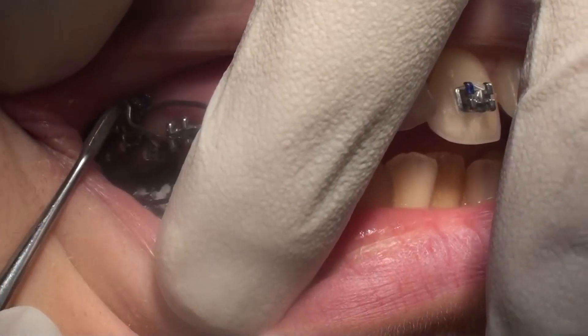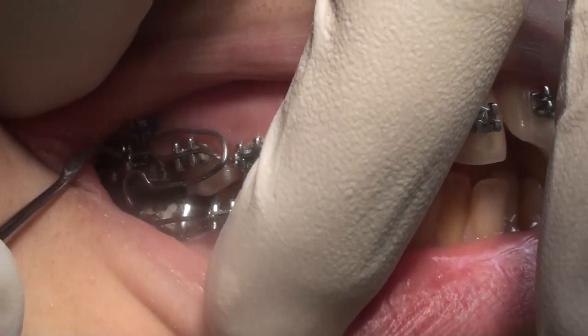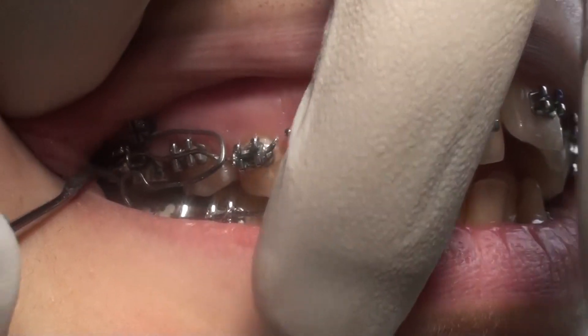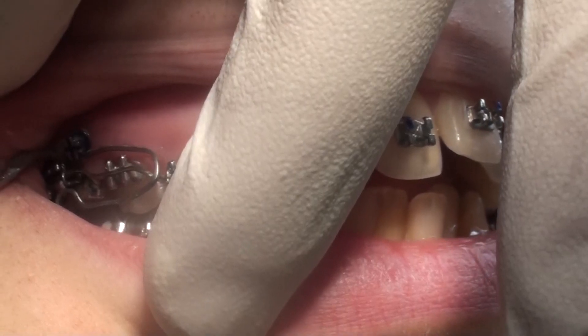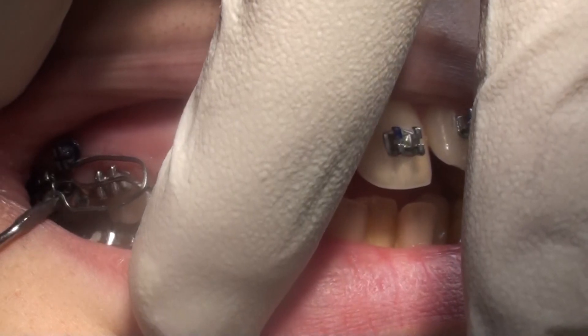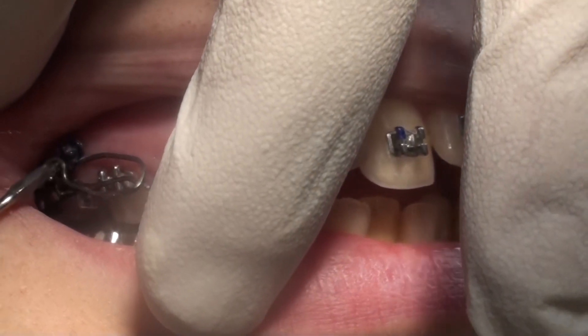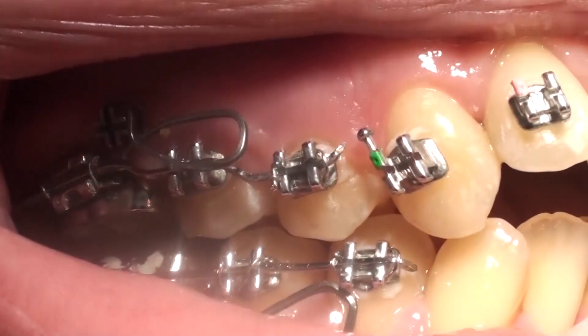In this video we can see a cantilever system that is used to intrude the posterior teeth. Here is the cantilever which is engaged into the auxiliary tube in the molar, and you see it now in its passive state or shape. This is its activation when it is brought up and hooked to the TAD.